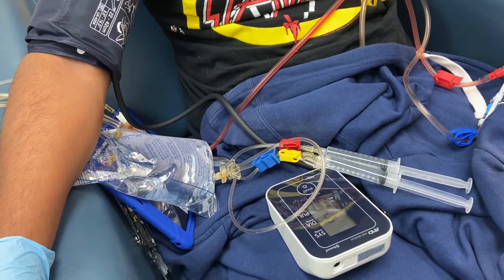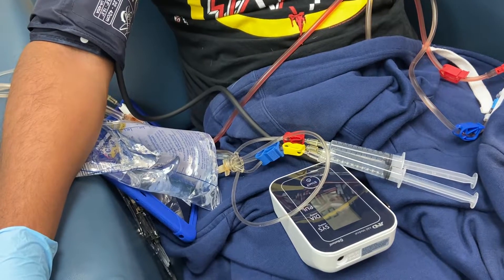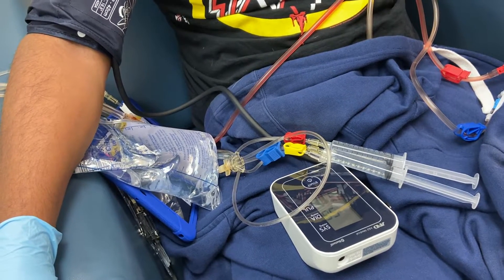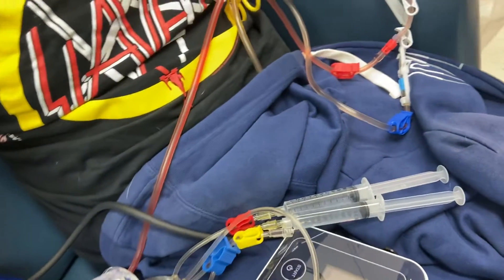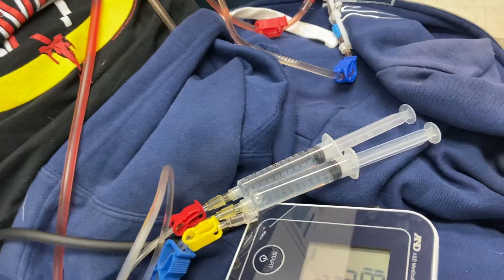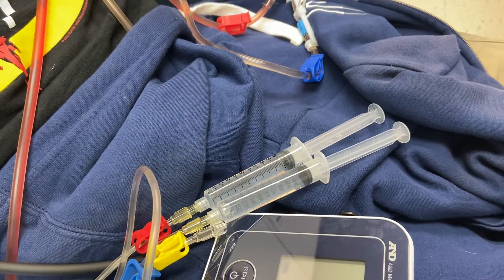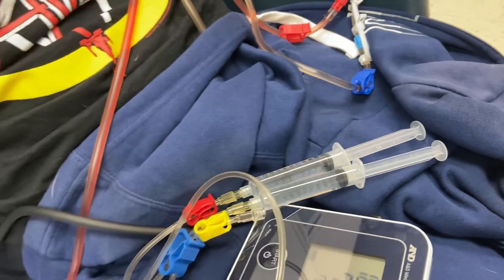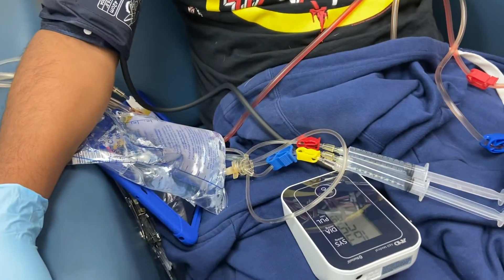Kindly write down the blood pressure, Evelyn, because we don't know how to retrieve the record from there. It's 163 over 75. Pulse is 79. Blood pressure is okay, so now we will disconnect.